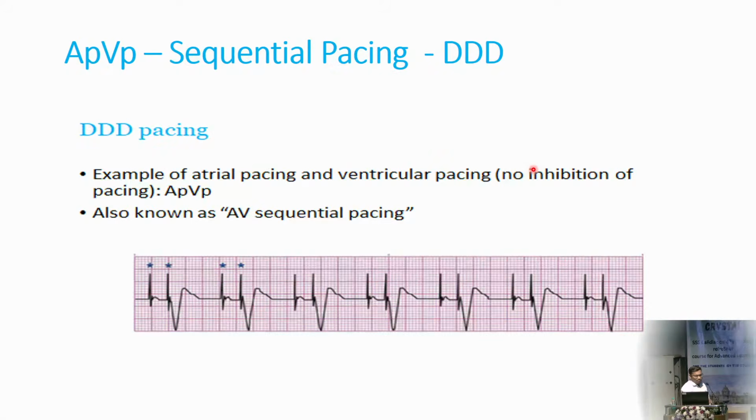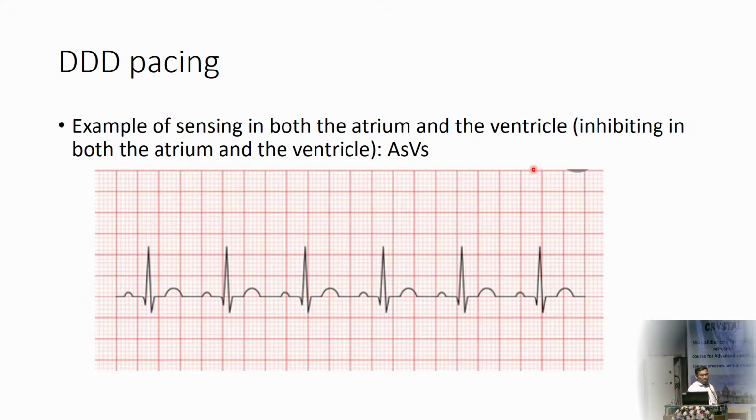Go back one, Anand. Is this a normal sinus rhythm in a normal person? Yes. He is not having atrial problems all the time. He is not having ventricular problems all the time. That's what he means by minimizing pacing. You don't want to pace because your pacing is usually caudocranial, and your QRS starts becoming wide. Why do you need to pace? You don't need to pace, right? So this could still be a pacemaker patient without spikes.